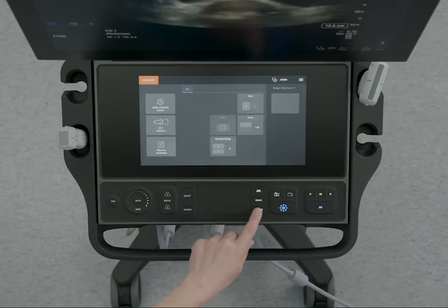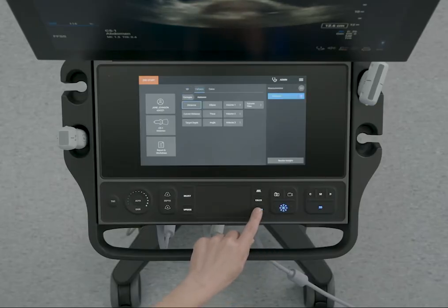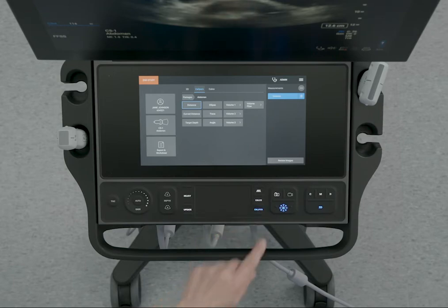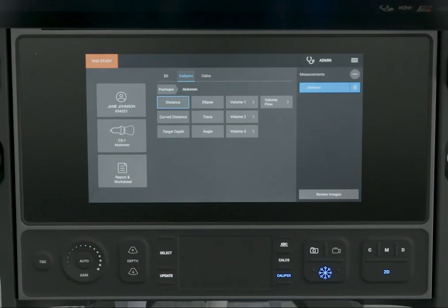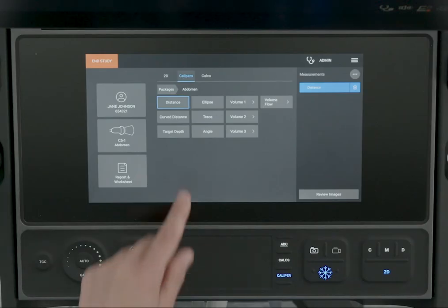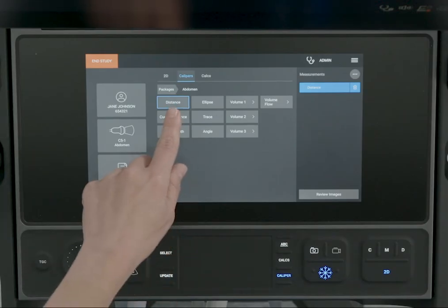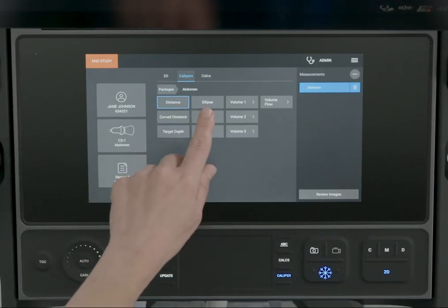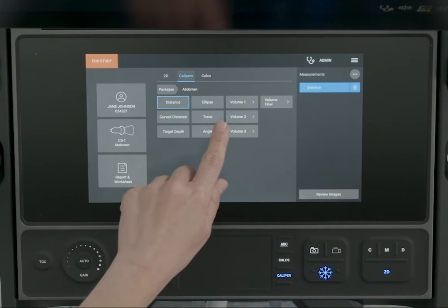While scanning, freeze the image and press the caliper control. Several basic measurements are available including distance, ellipse, and trace.